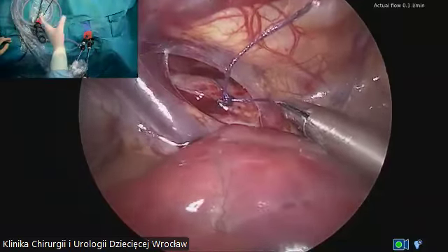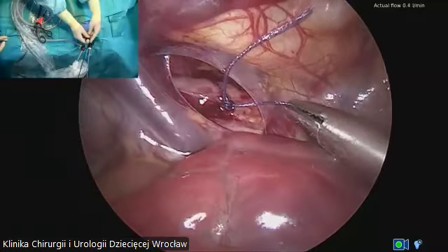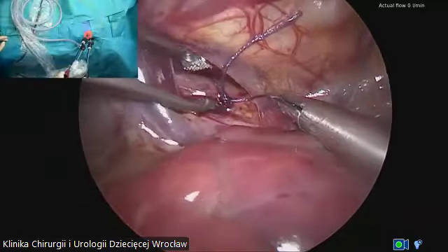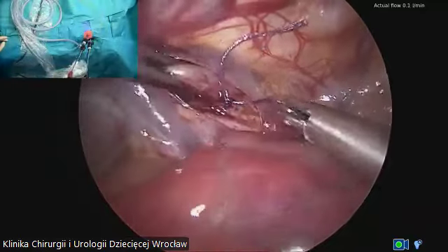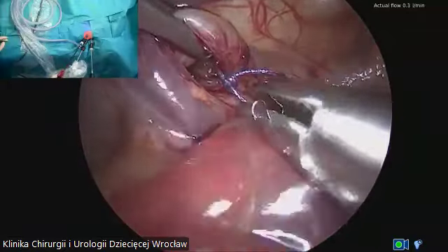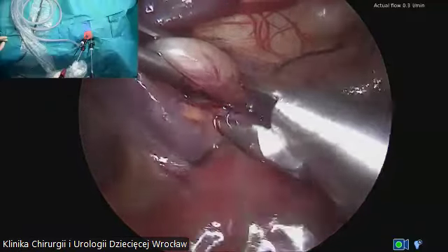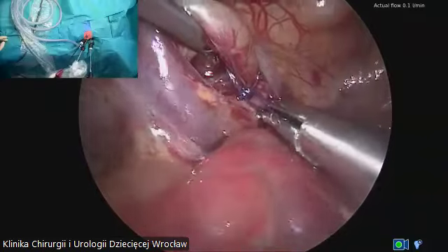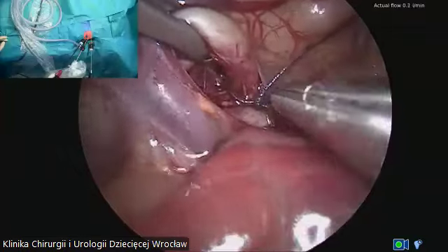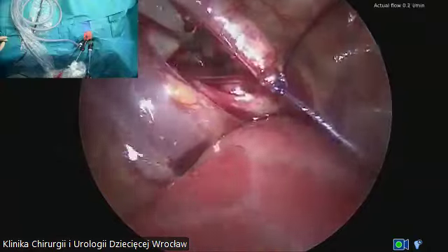That's a trick that we use to put the ligation just at the level of the trachea. You will see at the moment. So you can see that right now I take it up and I take the loop to another direction. Okay, right now it looks that it is on the level of trachea.